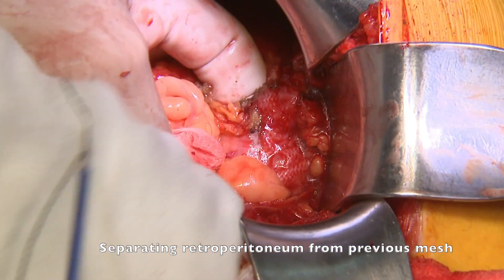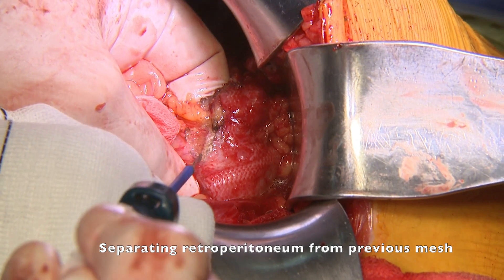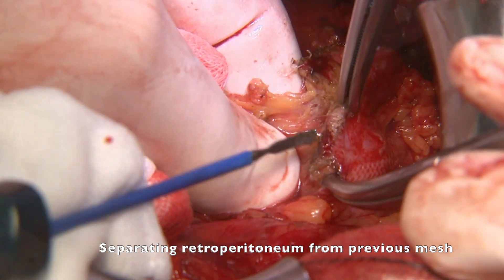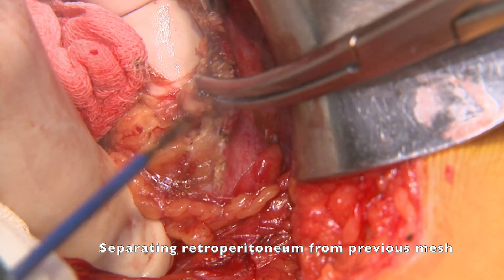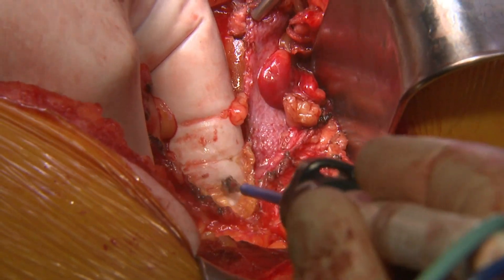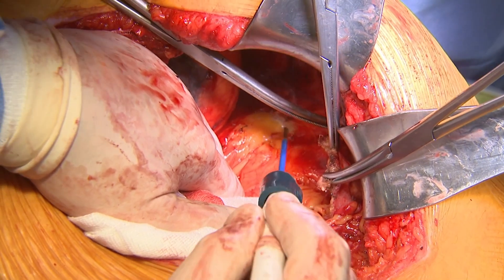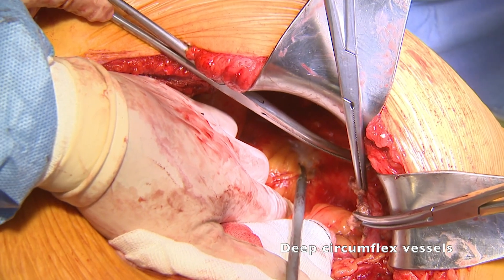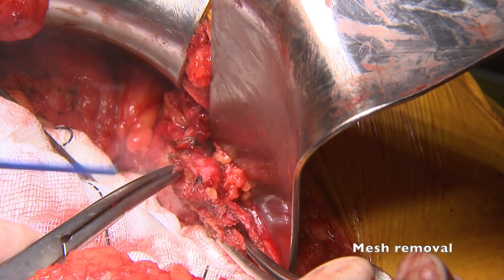We then come completely pre-peritoneal towards the inguinal area, where we observe a strong fixation with permanent spiral tacks over the retroperitoneum. It is important to have the left finger over the iliac vessels to protect them from this dissection. In order to remove the previous mesh, the dissection must be made trying to peel the mesh from any surrounding tissue. At the iliac area, it is very frequent to have to control bleeding from the deep circumflex vessels, which are constant and run not too far away from the ilioinguinal nerve.